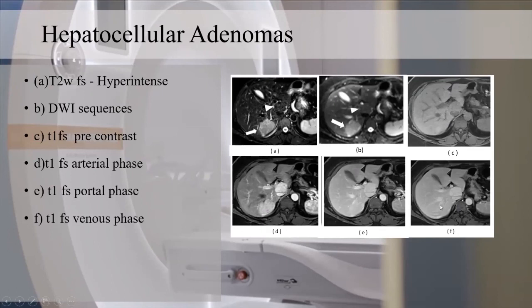So in hepatic adenoma, the T1 appearance can be variable actually. T1 usually will be hypointense, but there is a chance for iso also, but it can vary. And T2 will be mildly hyperintense. Diffusion restriction will be there. Then arterial phase contrast enhancement can be seen. So in hepatocellular adenoma, arterial enhancement can be seen, and there is no enhancement in the delayed phase or the venous phase.